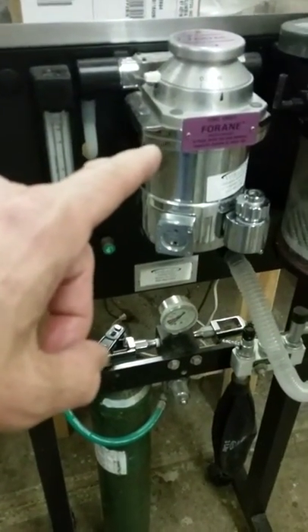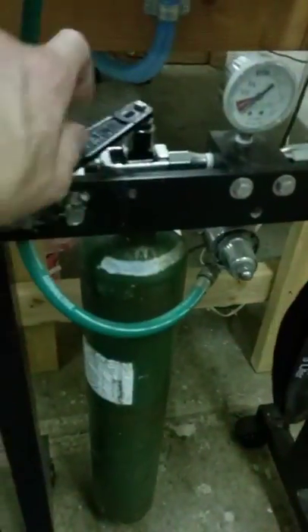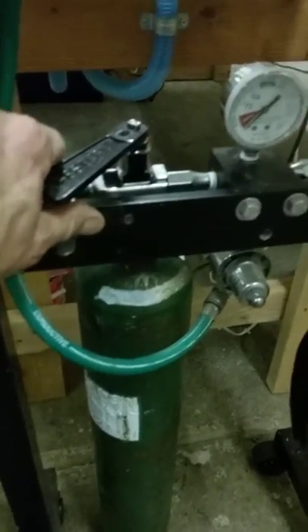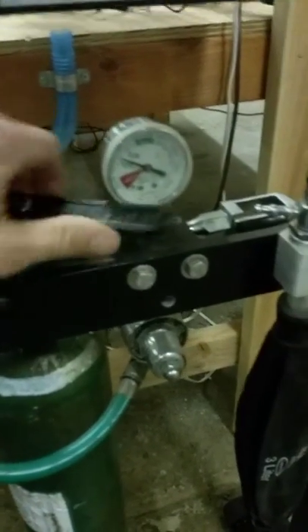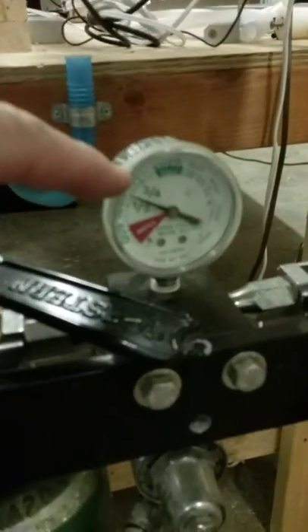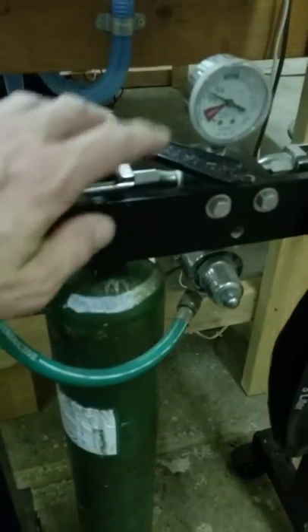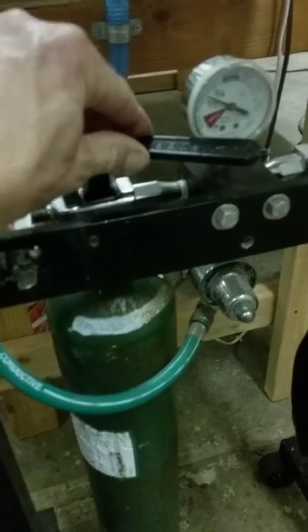To turn it on, first crack open the tank using the key. It's a typical lefty loosey turn, and you'll see as soon as you turn it on that the pressure meter registers — in this moment about half a tank of oxygen pressure. Turn the key a good 180 degrees to open it fully.